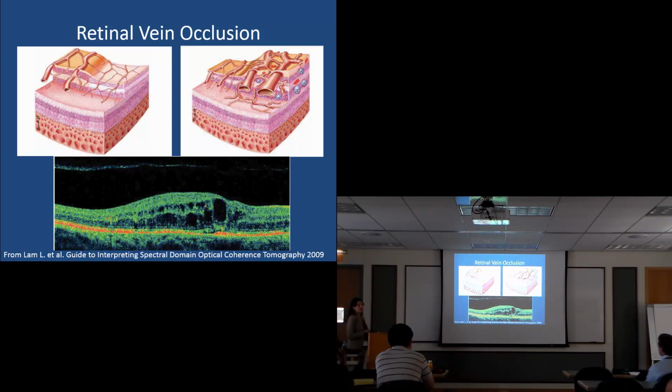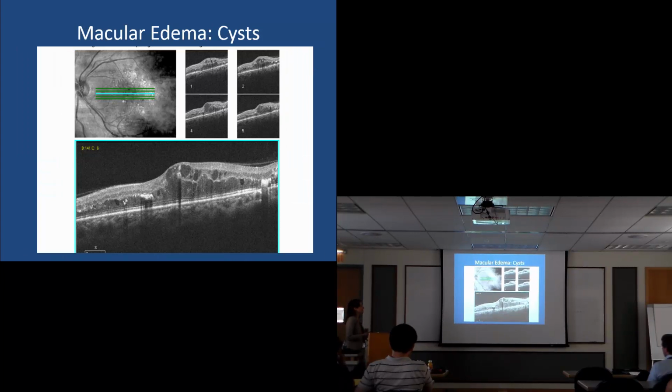This swelling in the retina, I tell patients it's like looking through water because there is water on their eye. And the longer it's there, the more it erodes and it's corrosive to the neurosensory retina underneath, so the sooner we have to treat it. And thankfully, we have treatment now. So just as this OCT imaging is coming out, our treatments are emerging, and that's really changing what we used to do for patients. Before, we would say we have no treatment. We'd watch these patients, and they go slowly down in their vision as that fluid sat there. Now we actually inject medicine into their eye, and it absorbs that fluid.